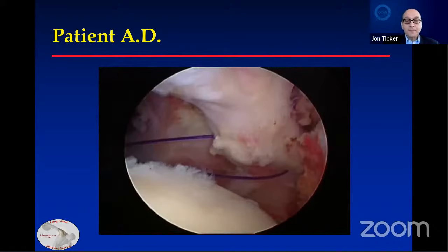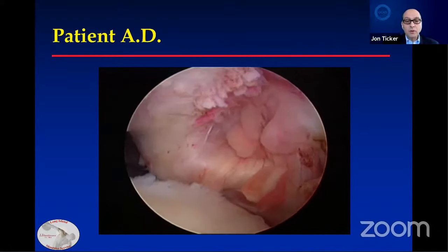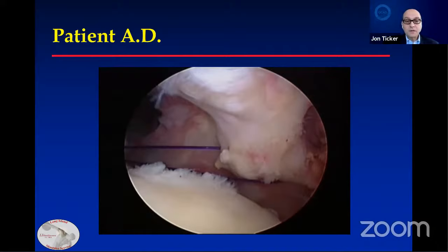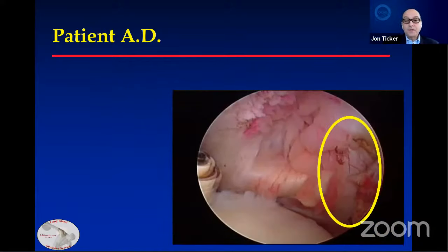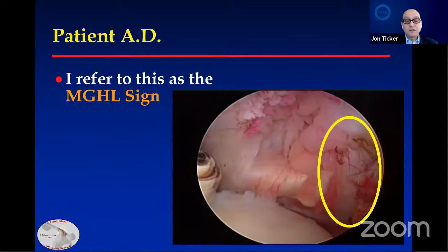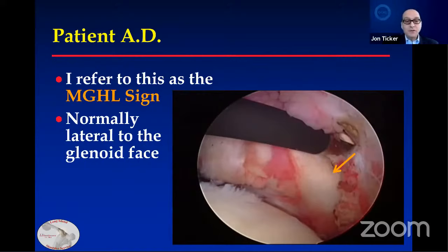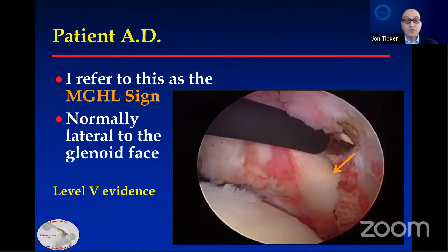I've placed a traction suture and I can pull a little more on the subscapularis. What that reveals is the middle glenohumeral ligament. In normal circumstances, this is lateral to the glenoid face, and I use that as a guide to what needs to be repaired. If I cannot see the middle glenohumeral ligament, I'm more than likely going to repair the subscapularis. This is level five evidence, but it helps me identify tissue that needs to be repaired. I am going to release this as part of the surgery, however.